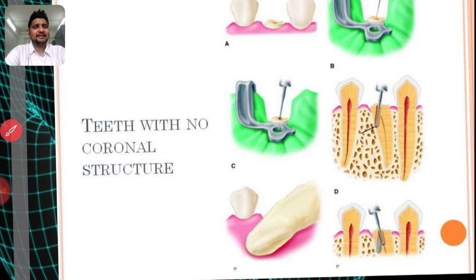So just take care when you have tilted teeth, tilted roots, you can very easily perforate. So always know where the tooth is tilted. It's a small thing, but it makes the difference between a successful case and a failure case. Endo is beautiful, if you just do it right and follow these small hints I'm talking to you about.